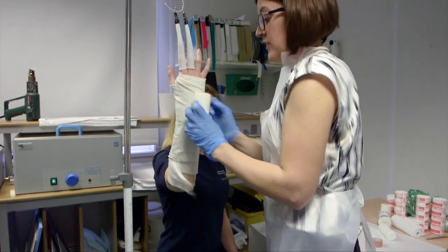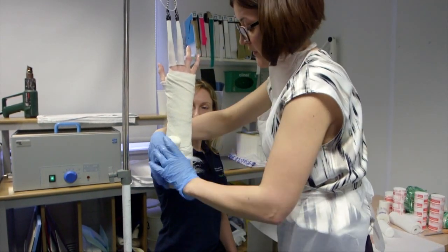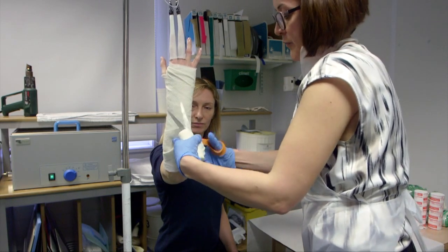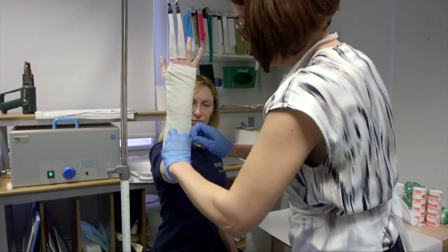The MCPJs, the fingers, and the thumb must be left free to allow the patient to exercise the fingers and prevent swelling. You can see how simple it is to apply the backslab with just one person when the finger traps are used.